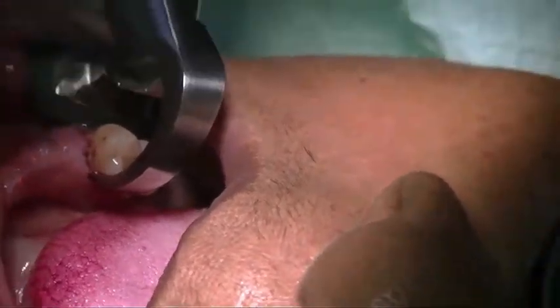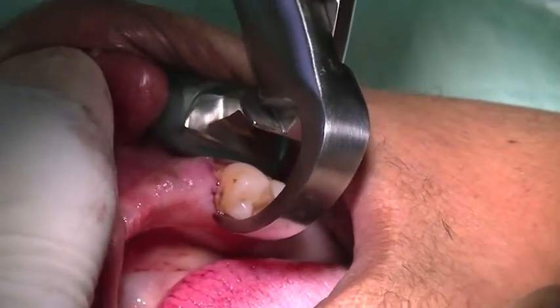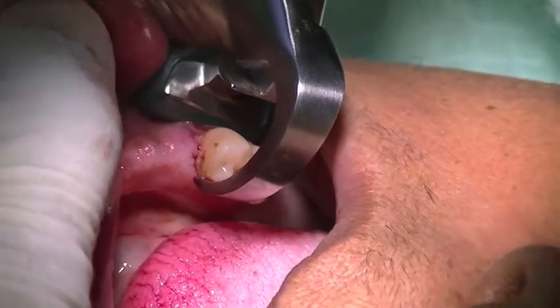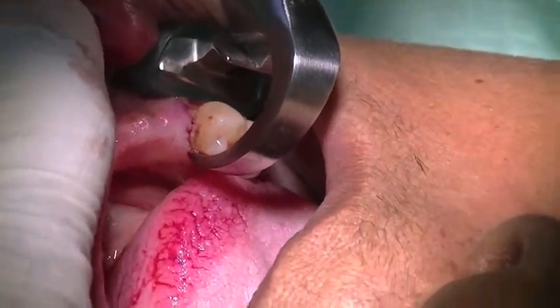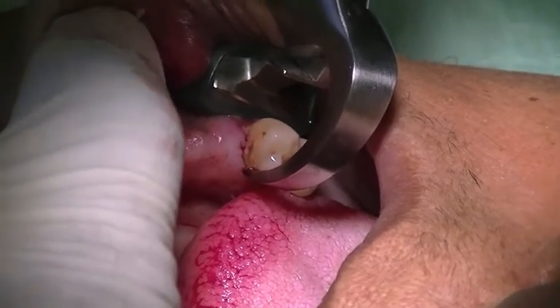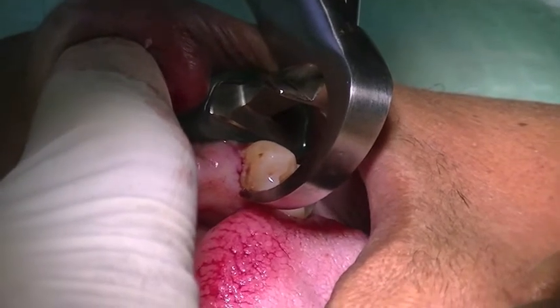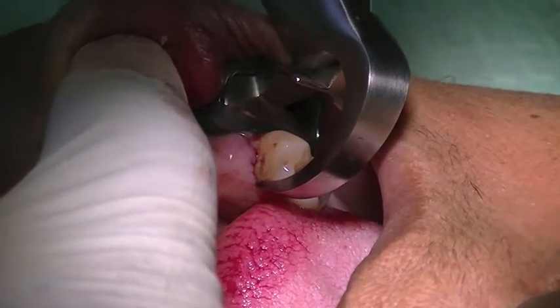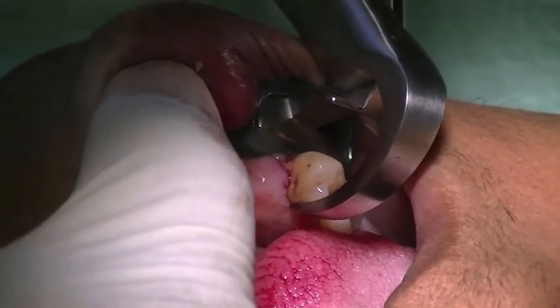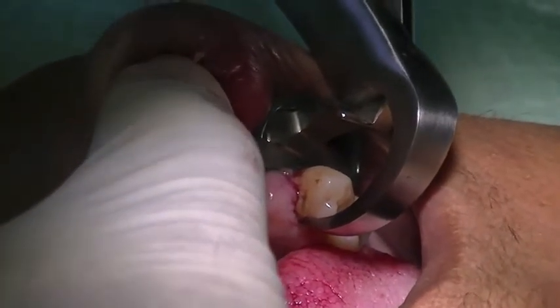Alright, go ahead and raise your chin up for me a little bit now. Perfect. Once again, hand position to ensure that I don't clamp down on the forceps, and we're just going to rotate the wrist. Alright, we've already got it releasing. And can you raise your chin up just a little bit more? Perfect, perfect.